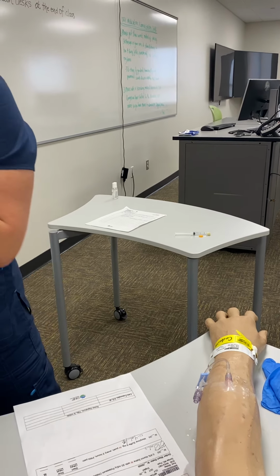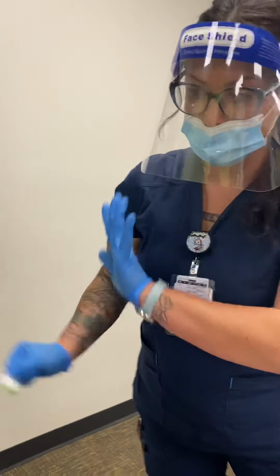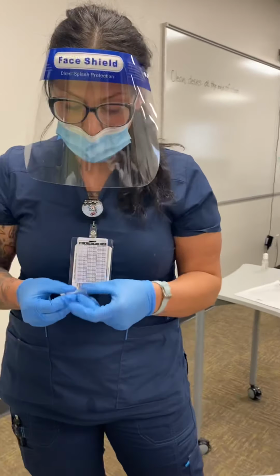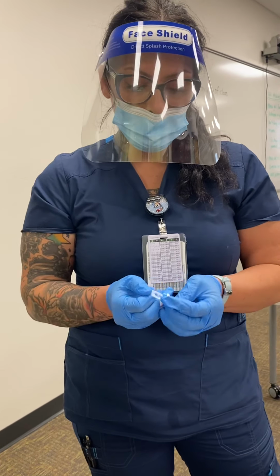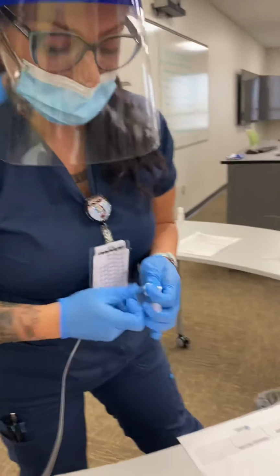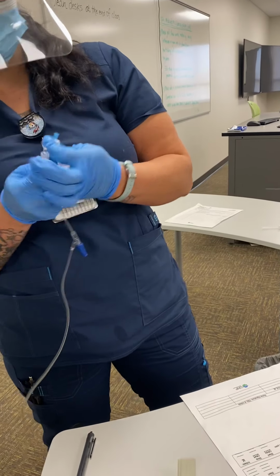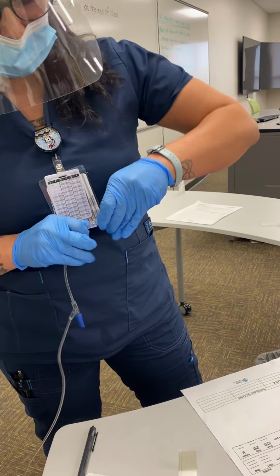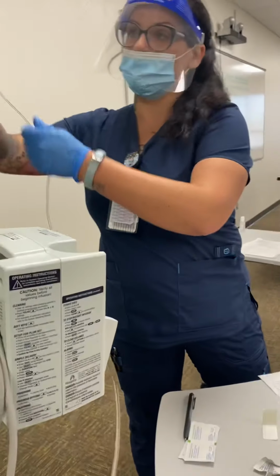So I also would have put my IV label on my IV tubing so that we know when it was started and by whom for the next nurse on shift. All right, so I just want to go ahead and I would clean this port since it's been sitting in air for a minute. And just attach this so that it stays sterile in case we need to use this tubing again.